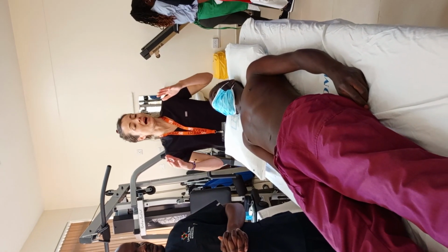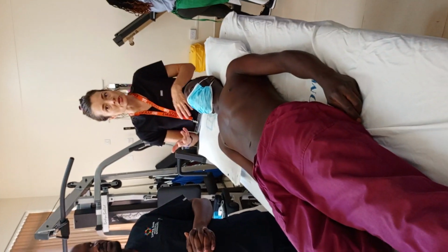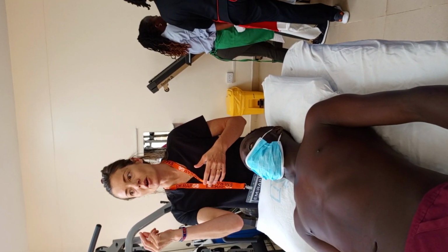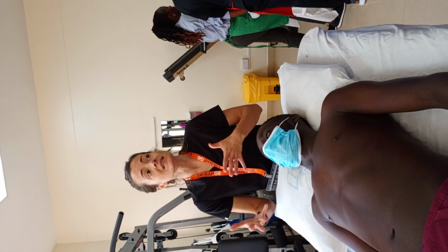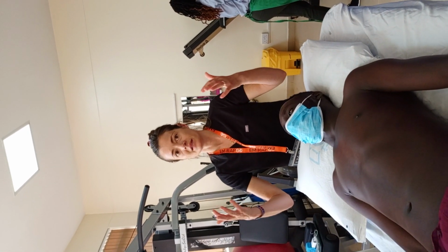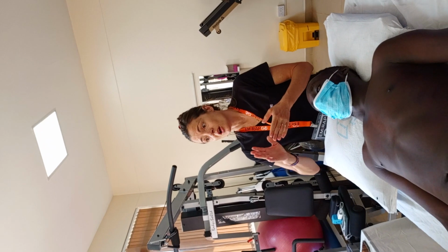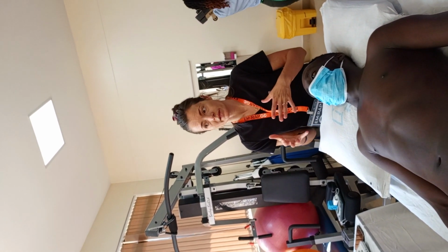Okay. So I know that ultrasound might not be as accessible, but I want to introduce you to ultrasound, how it works, how to use it. I think especially in a setting where you don't have rapid access to a CT scanner or even a chest x-ray, this is the easiest way to assess someone and look directly into the body and the internal organs and assess what's the function of the heart. Do the lungs have a bunch of fluid in them? Is there free fluid in the abdomen? Is there hydronephrosis? All of these you can see so quickly on ultrasound.